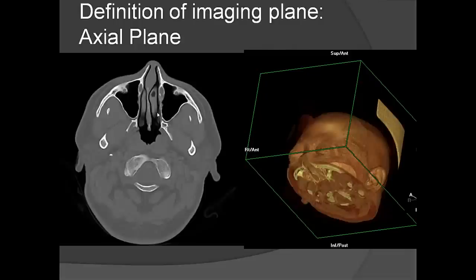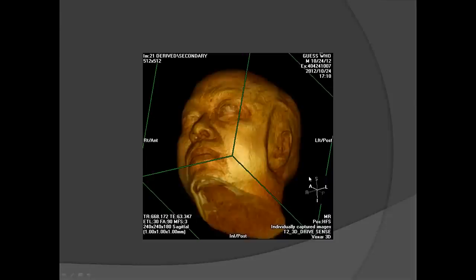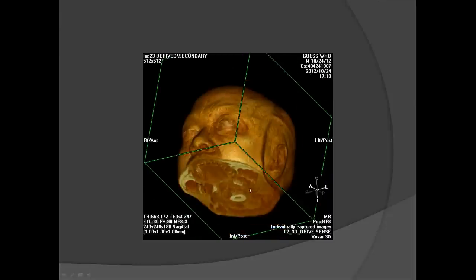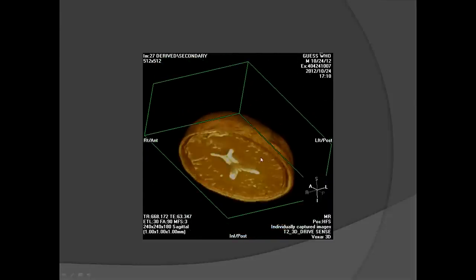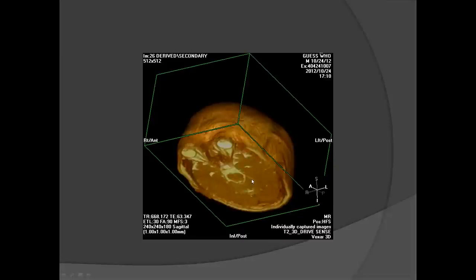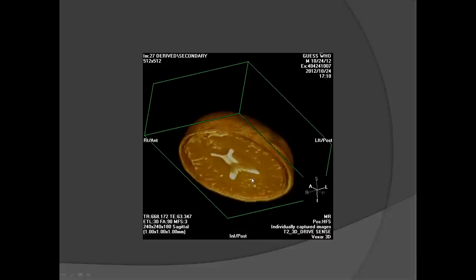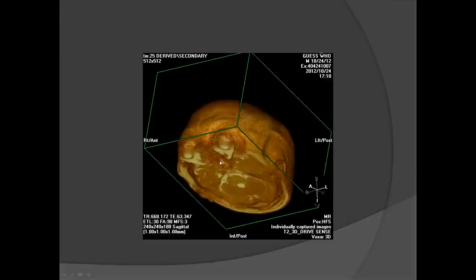First, a definition of orbital imaging planes. In the axial plane, you cut from bottom to top and can see the eyeballs and the brain. In the axial view, the patient's head is inside the screen and feet are toward us, so the patient's left side is on our right side.